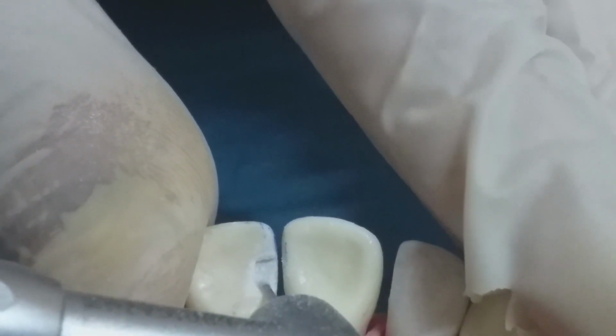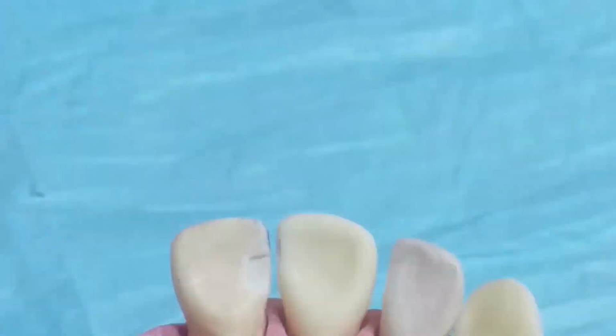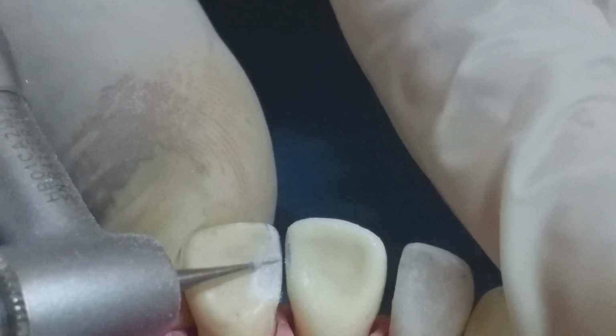Finishing our cavity, smoothing the floor, rounding the angles, the angle of walls, all will be good.